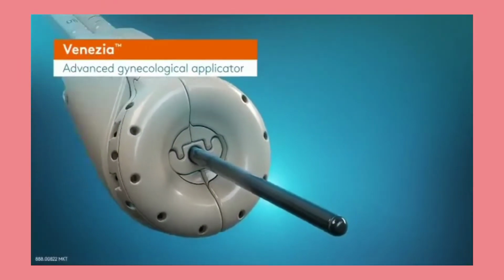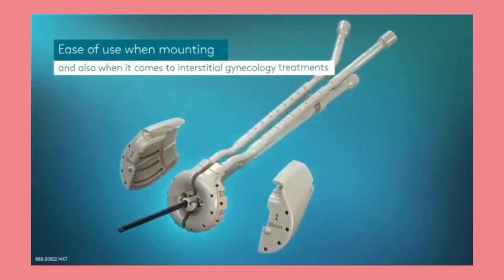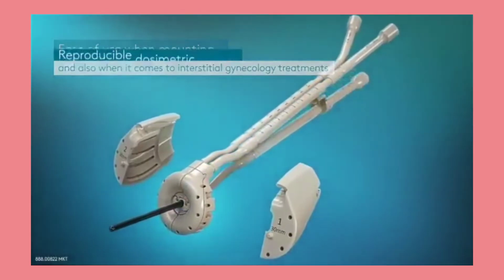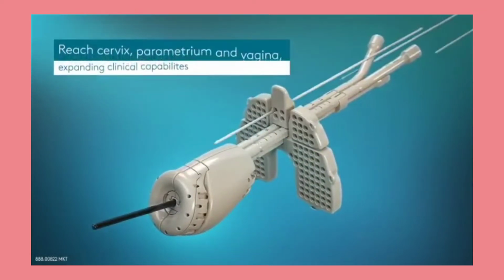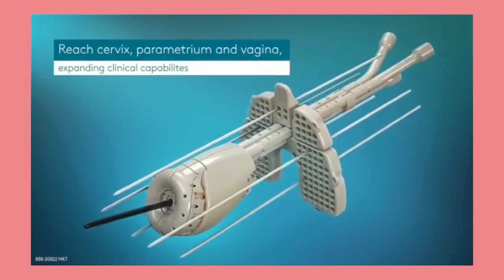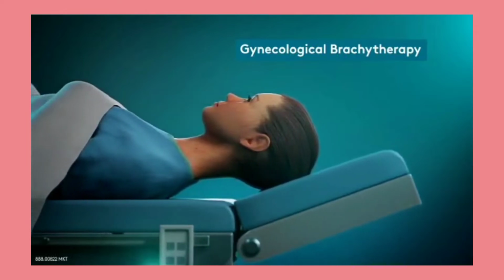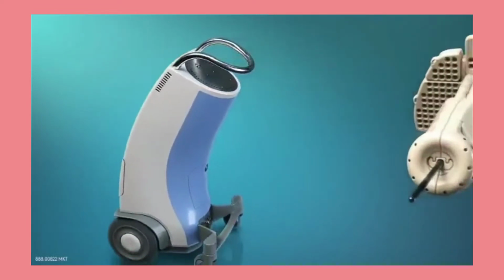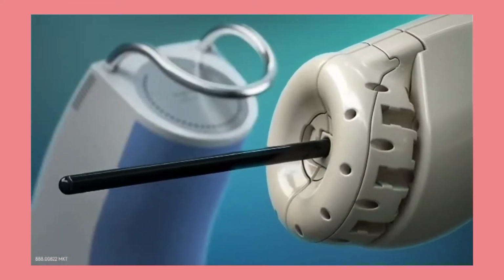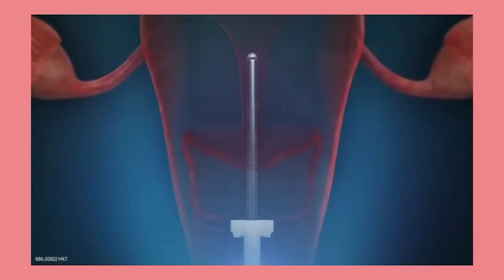So, what are the expectations during the procedure? HDR brachytherapy is usually performed as a short series of outpatient procedures outside the hospital, though treatments for certain types of cancer may be performed in the hospital. Depending on which part of the body is being treated, you may receive local anesthesia to numb an injection site, sedation, or general anesthesia if catheters must be implanted.